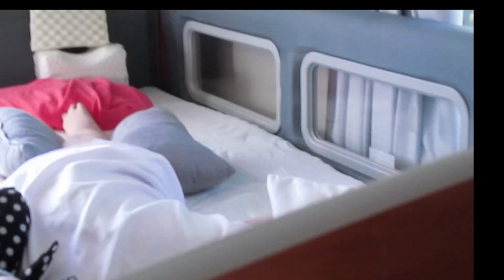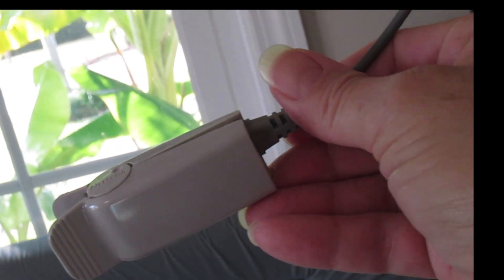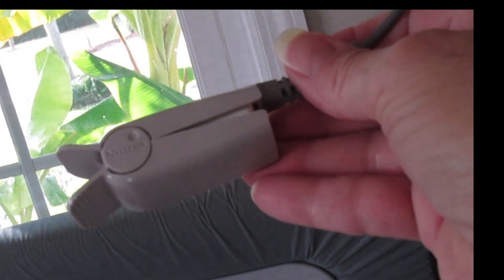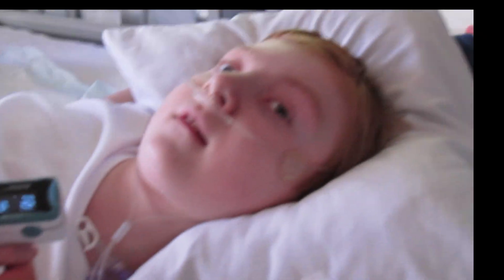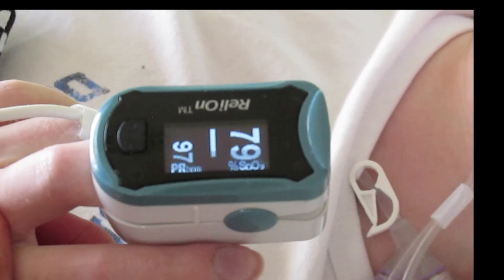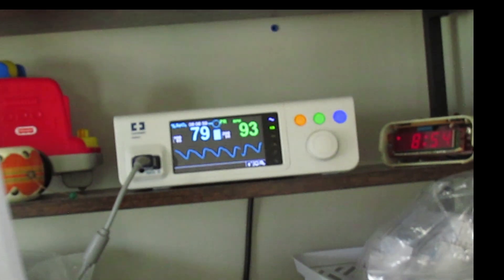We've also bought a removable finger sensor that we can use when we don't have the sticky sensors. This is an adult one — it kind of squishes his finger. I don't really like to use it because it clamps down pretty hard, but it plugs directly into the pulse ox with the same kind of plug. Otherwise it's looking good — SpO2 is reading 80, heart rate 95 here and 96 there, so we're confident this sensor is attached and working as it should.